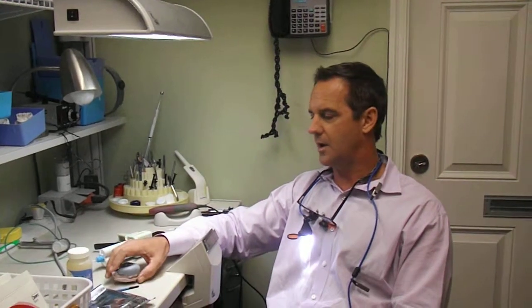Some of the benefits to doing an indirect provisional as compared to direct: number one, while my assistant is placing retraction cord — which she is doing right now — I'm making the provisional, so we're doing two things at one time. The second is that we're not curing the bisacryl on the preps before impression or bonding our provisional, so we're not getting an oxygen-inhibited layer and any other contaminants on the teeth that could affect our impression.